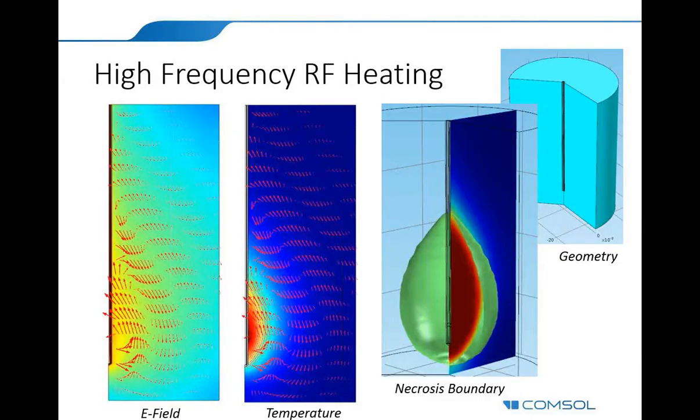I will allude to this one. This is basically the same sort of thing. However, now what we have is honest-to-goodness microwave heating. So what we've got is a megahertz wave that is traveling down a catheter where the shielding has been cut down at the bottom, and so you see the waves escaping, acting like a simple antenna. Just like in Joule heating, the J·E term, with some frequency terms built into it, is going to turn into heat, and that heat, of course, will warm up the tissue. And then, just like what we did before, we're going to be looking at where's the dead tissue and where's the not dead tissue.